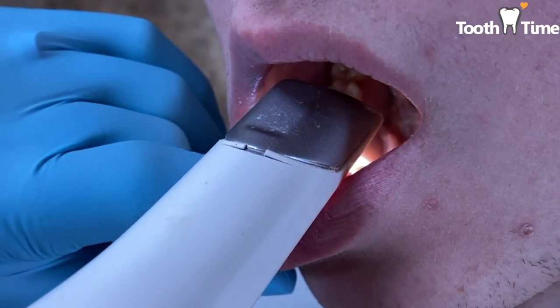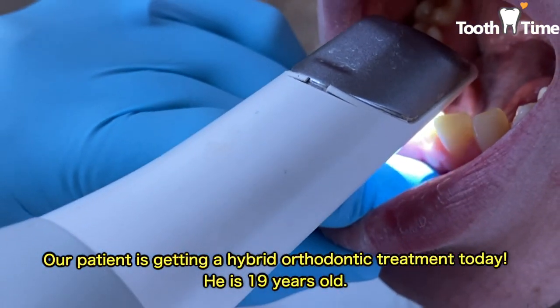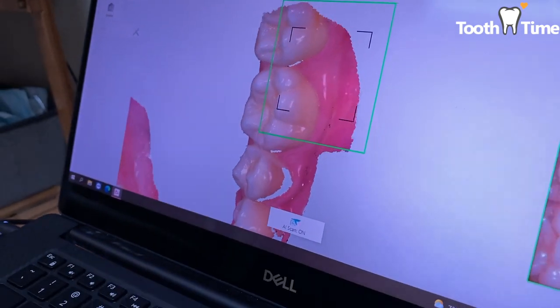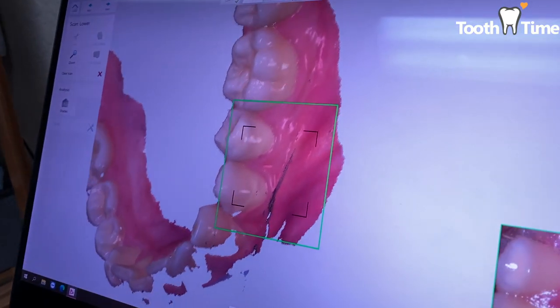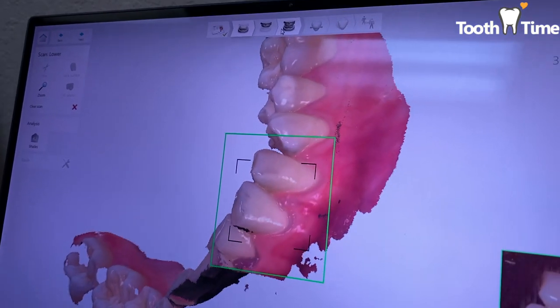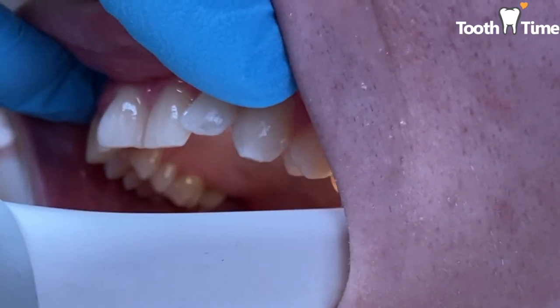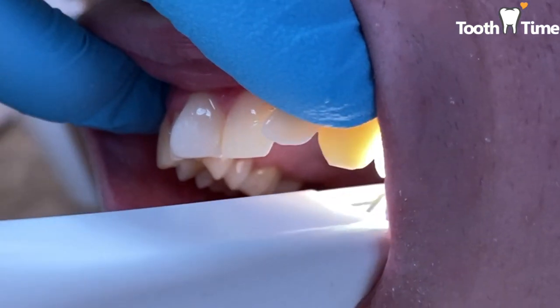Let's go. Here we have a 19-year-old patient who was solely interested in clear liners. Due to his moderate crowding on the bottom, we decided that we were going to go ahead and transition him into clear aligners, but first we wanted to start as a hybrid case. A hybrid case is when you do half clear aligners and half traditional braces.